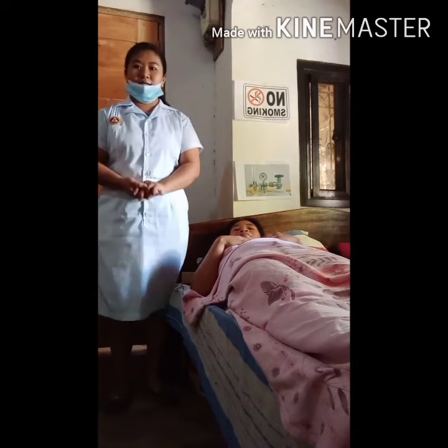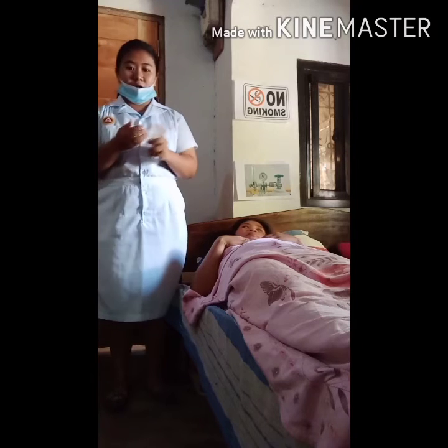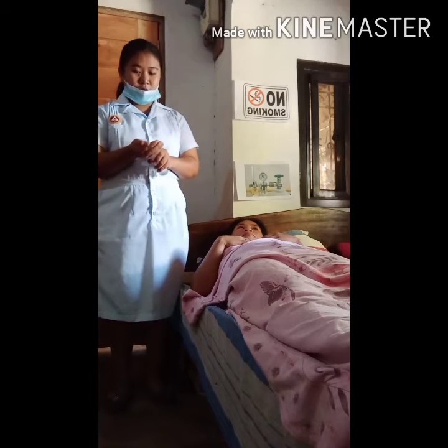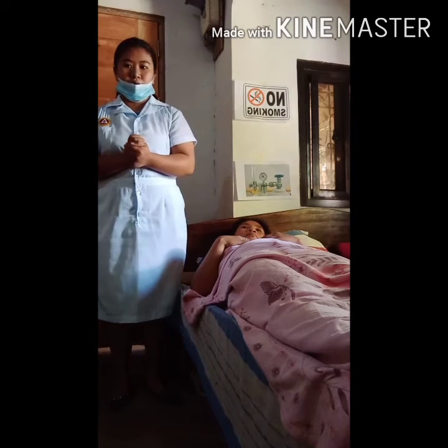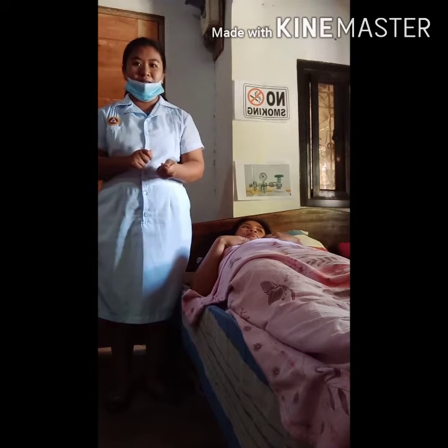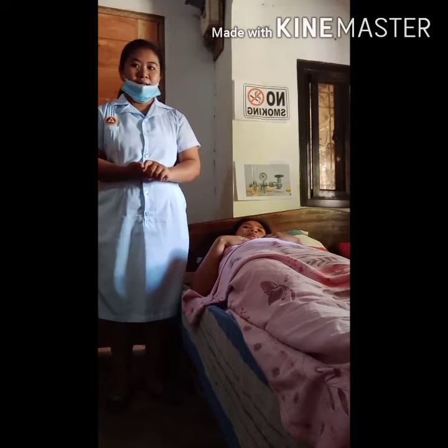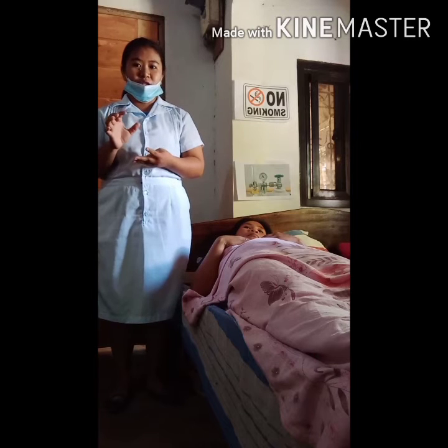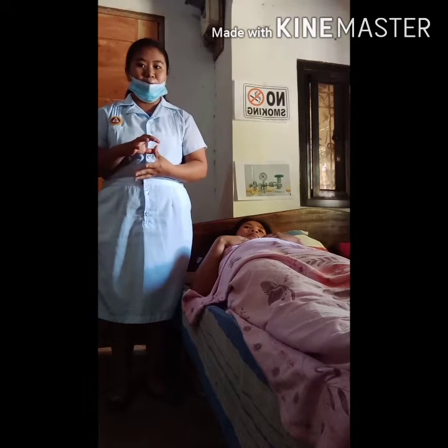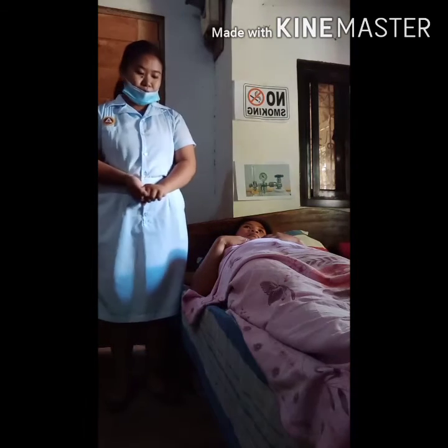And then next is wash your hands or apply alcohol for infection control. And then next is identify the client and proceed with the 5 rights of medication administration: the right patient, right drug, right dose, right route, and right time. And next is explain the procedure to the client.